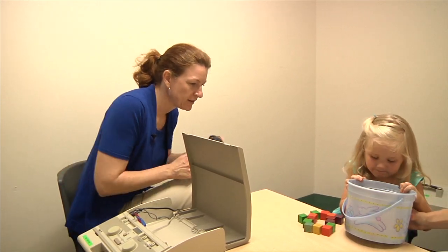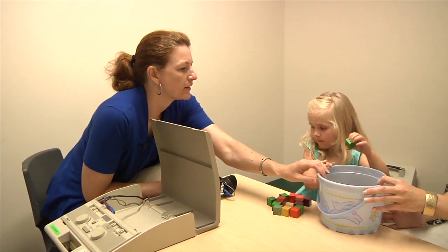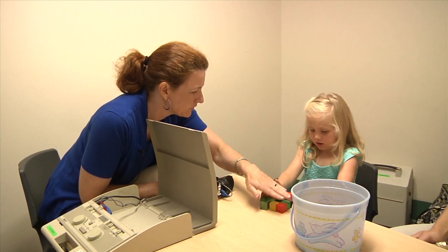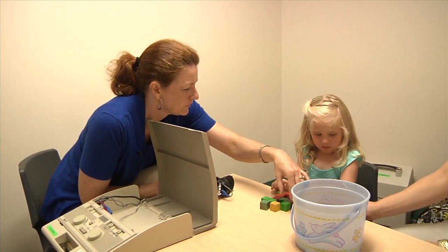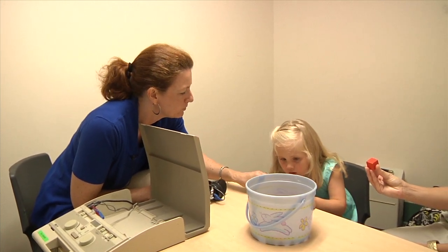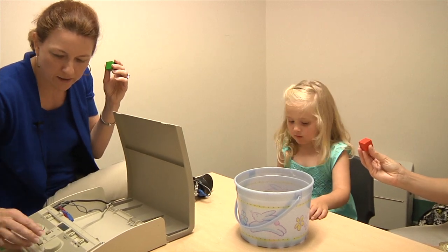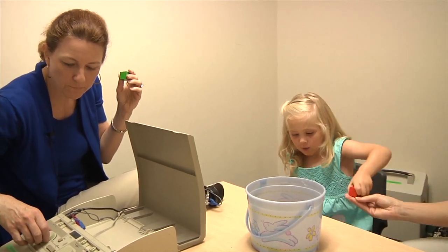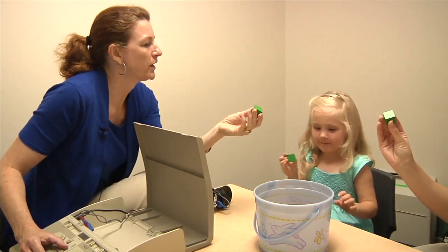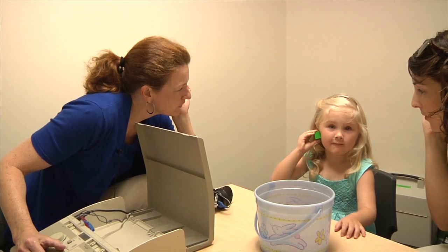Okay, Elena, I'm going to put these earphones on the table. Okay, let's put the bucket over here, and we're going to listen for that beep together. Actually, we'll have your mom listen too. Remember that first game we played? Let's see who can do it first. Hold on to your block. Okay. I am going to present a loud beep here. We both have green ones. Yes. Oh, and I have a green one too. You ready? Okay, hold it up near your ear. Are we listening? Let's see who can hear it first.